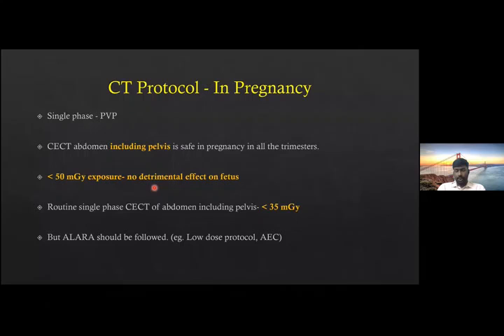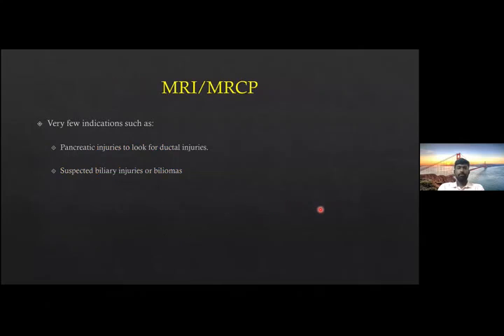It has been shown that there is no detrimental effect on the fetus. A routine single-phase CT of the abdomen would have an exposure of just less than 35 milligray, so it is safe. And it's always better to follow the ALARA principle with low dose protocols and automatic exposure control.